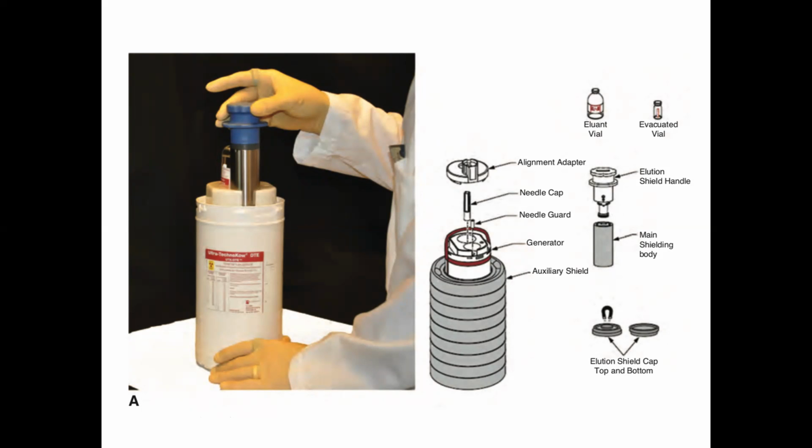Short answer is for SPECT, or single photon emission tomography, it gets delivered once a week, right? And it gets delivered in this container. And actually there is a small nuclear decay going on inside this container for that whole week. And the tech is going to go up to this and pull out a certain amount of material to image, and it will have a decay rate itself, the stuff that you pull out.